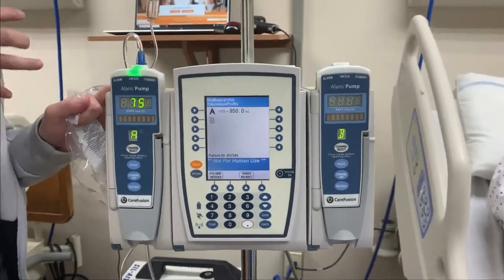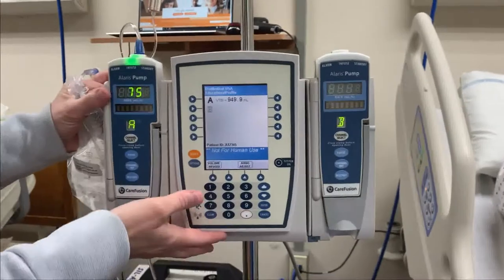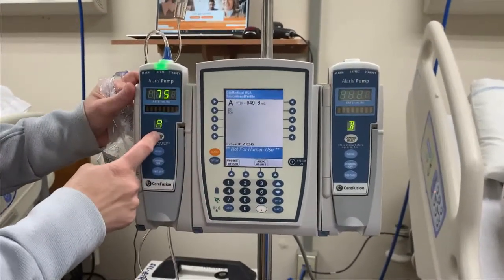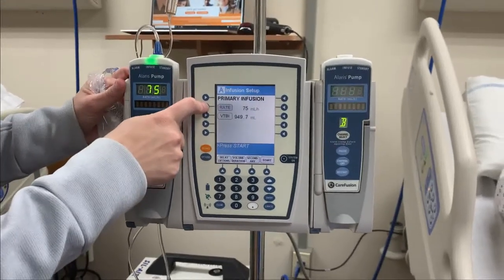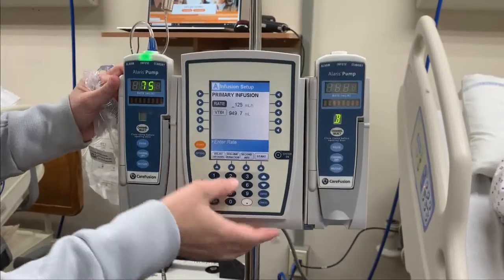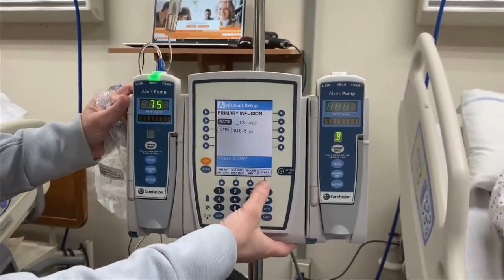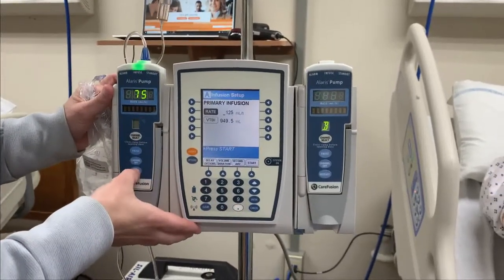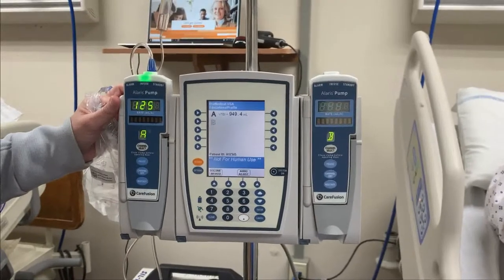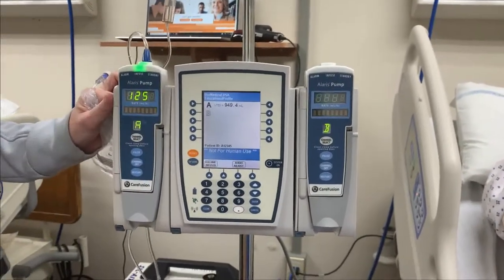If you need to slow this rate down or speed it up because something has changed for your patient, all you need to do is hit channel select A and you're able to go right back in to where you were. Let's say they want to increase it to 125 — my volume to be infused does not need to change. When I'm ready, I hit start, and our rate has changed to the new prescribed rate.